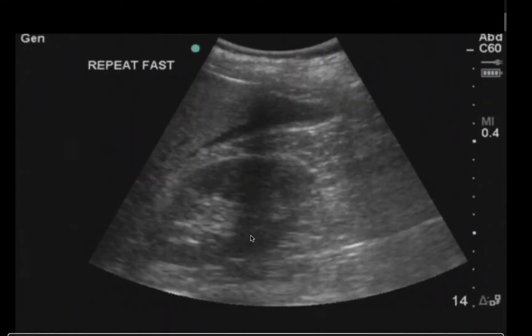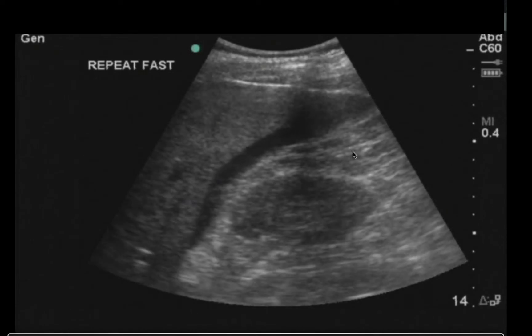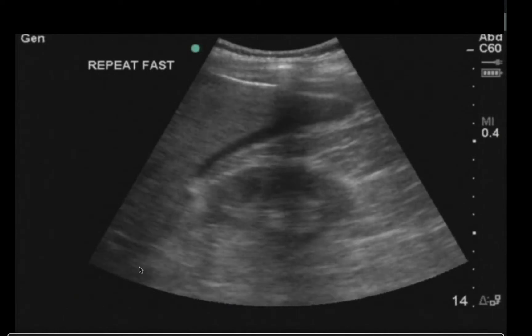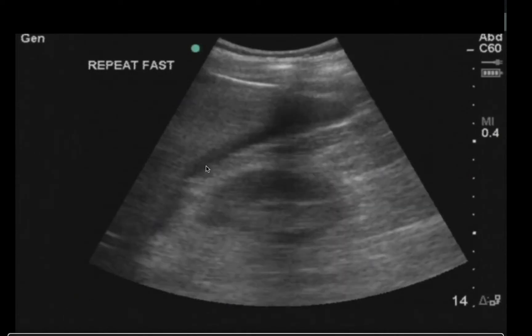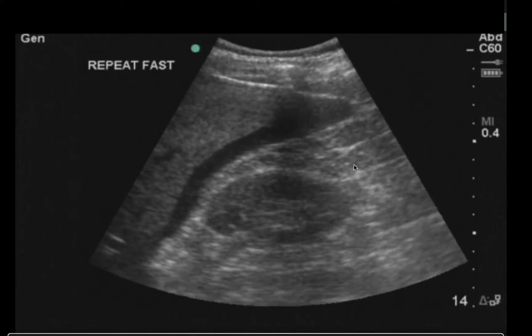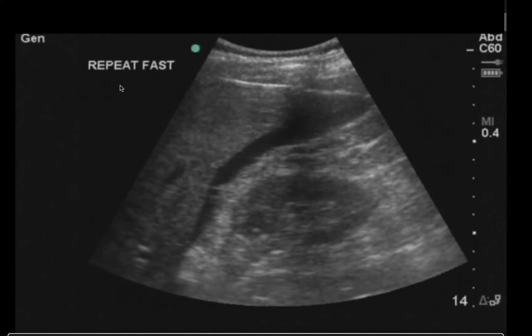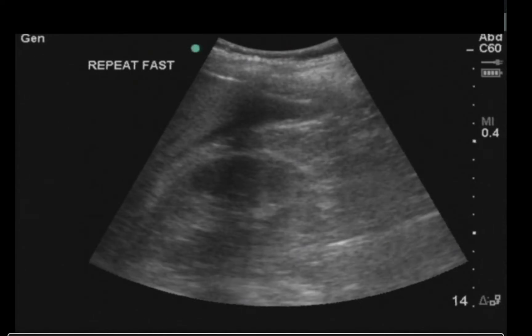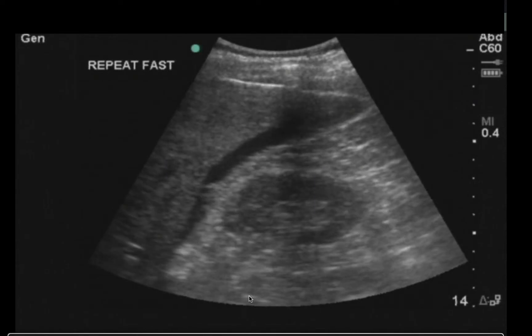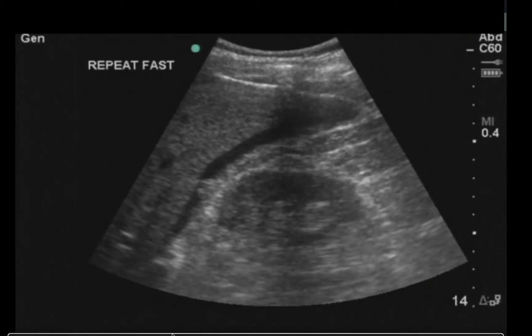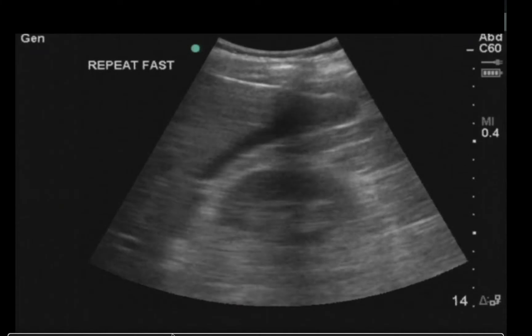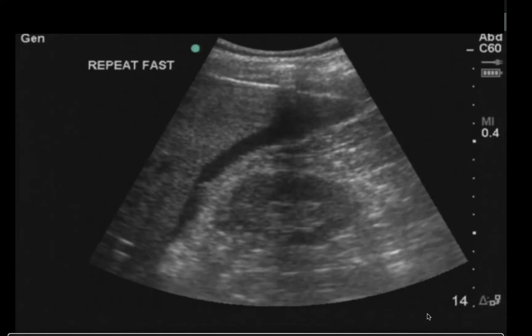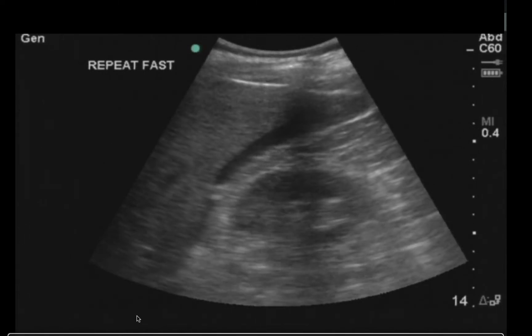Here's a repeat FAST. The depth is a little suboptimal but we found the finding: a fluid collection around the tip of the liver. You can use a repeat FAST if your first FAST is negative and the patient is getting worse, or when a patient has a known abdominal injury and care is being delayed — such as when IR is busy. This can help you triage by seeing how much fluid is accumulating.